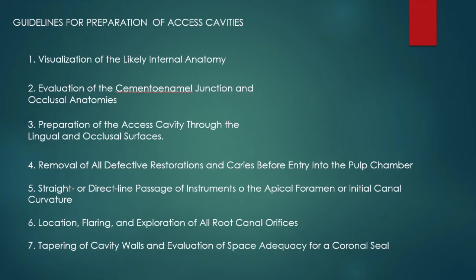And finally, guideline number 7, which is tapering of the cavity wall of the access cavity. This is to provide an adequate space for temporary filling that should provide an adequate coronal seal between visits.